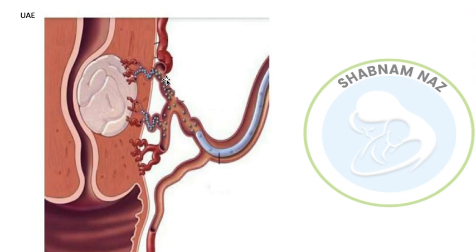We have to counsel our patient after introduction, aim of consultation, setting the agenda and asking about the procedure. Do you know about that procedure? Okay, I'm telling you this is a procedure which involves inserting a long tube into the blood vessel on your thigh and passing it to the vessel that supplies the womb, and then injecting small particles that block those vessels. This will cut the blood supply to the fibroid, causing it to shrink in size, and it will not bleed with your periods every month.